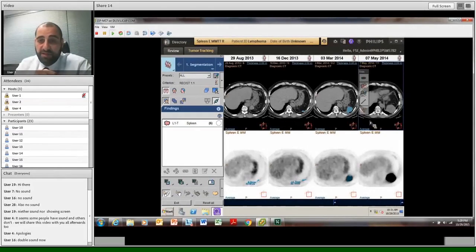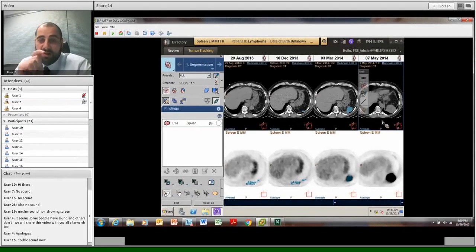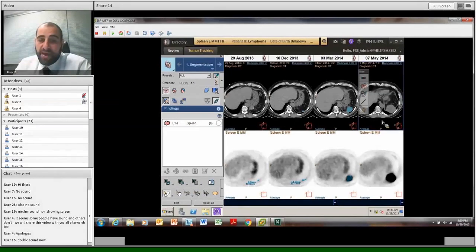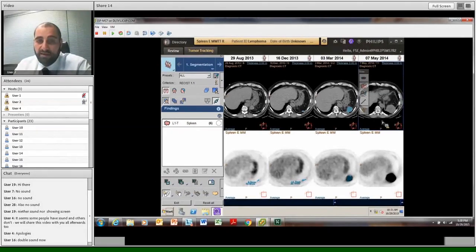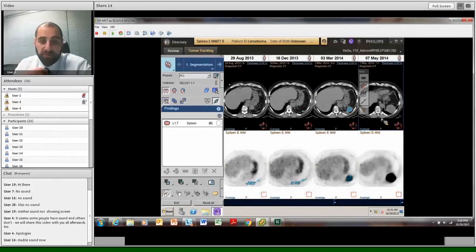So if you have a look here now, at the top row there, I've got the 29th of August, 2013, 16th of December. These are separate points during the cycle at which the patient has presented to radiology.